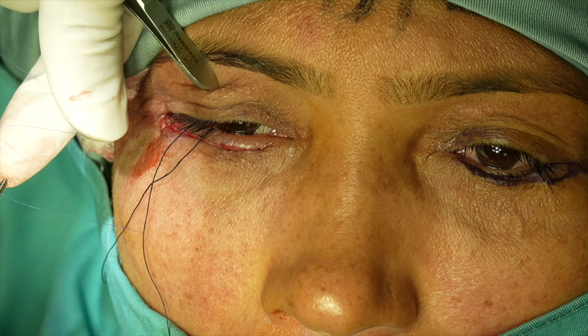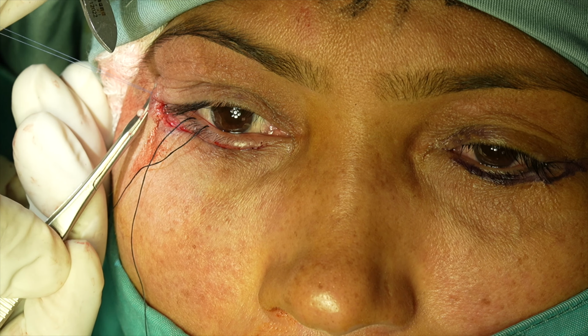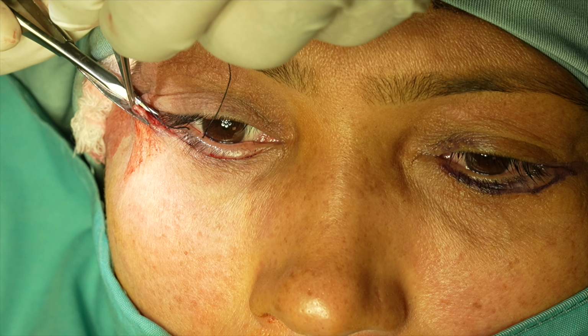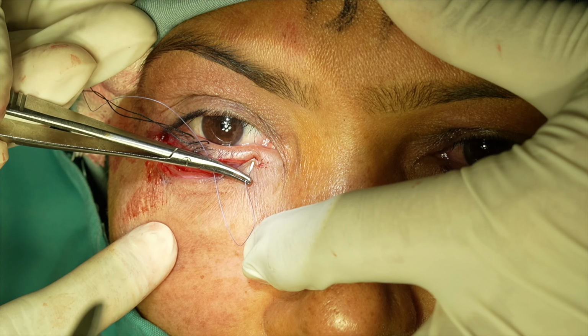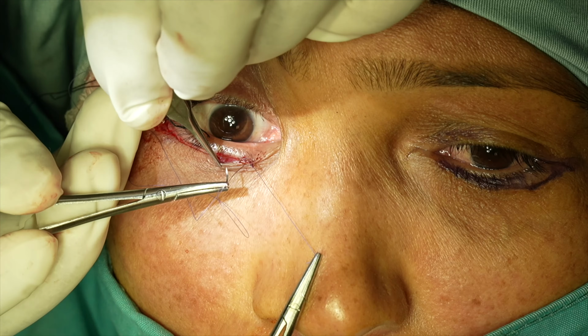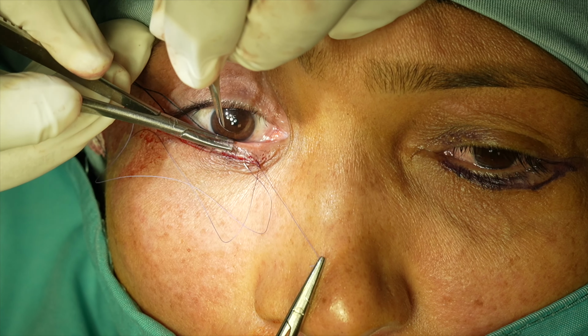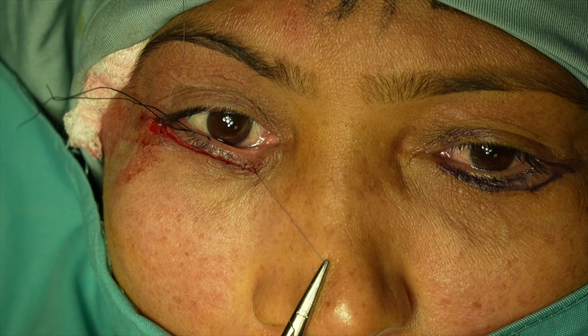To further refine the lateral contour and prevent dog ear formation, a small triangular segment of redundant lateral skin is conservatively excised. Skin closure is then completed with a continuous 6-0 or 7-0 Vicryl suture using a smooth, tension-free approximation and optimal cosmetic outcome.